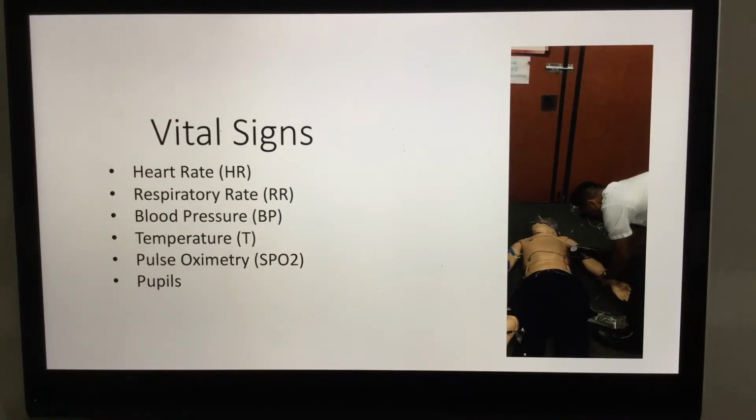If you pumped up the blood pressure and it stopped at 100, we're going to go up 20 more, so 100 plus 20 is 120. If you pumped up the blood pressure and it stopped at 180, we're going to go up 20 more points. 180 plus 20 is 200. So always, whenever you pump the blood pressure cuff up and you lose the pulse, wherever you lose the pulse, we're going to pump it up 20 increments more.